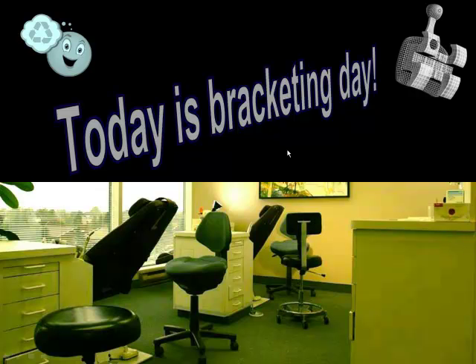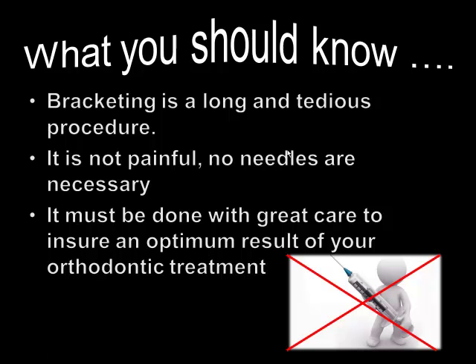Today is bracketing day — your first day with your new orthodontic brackets. What you should know before we start: bracketing is a long and tedious procedure, so you have to be patient. It's not painful and we don't use any needles, but we have to apply a lot of care to make sure that we are going to place the brackets where they're supposed to be, to ensure that you get the best possible result.